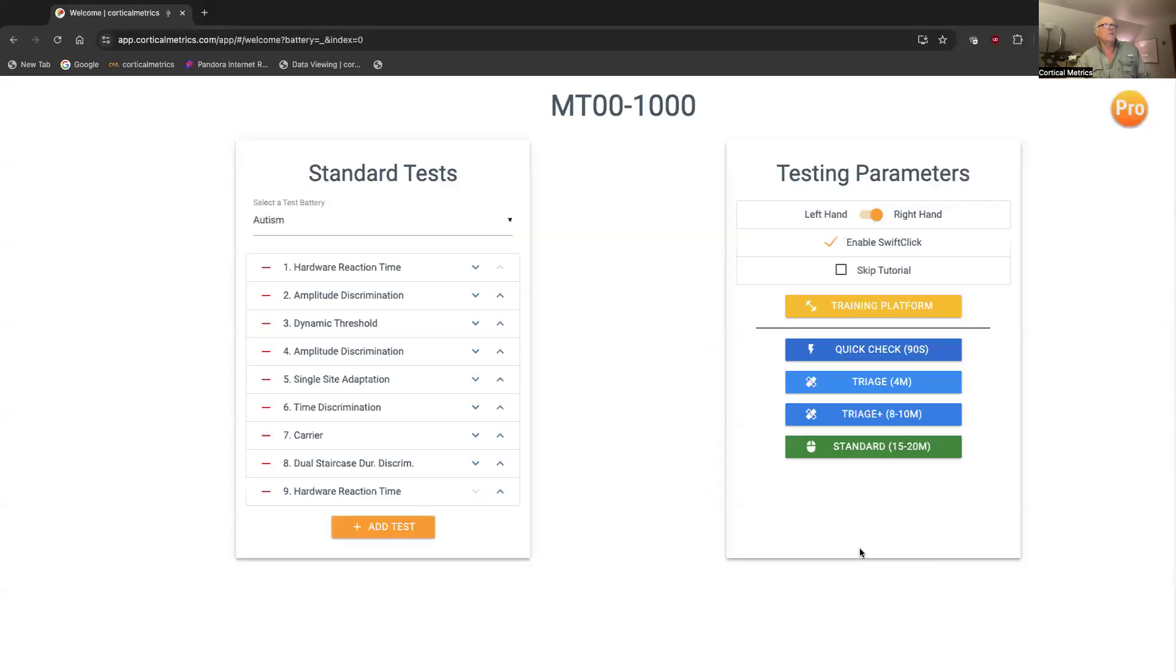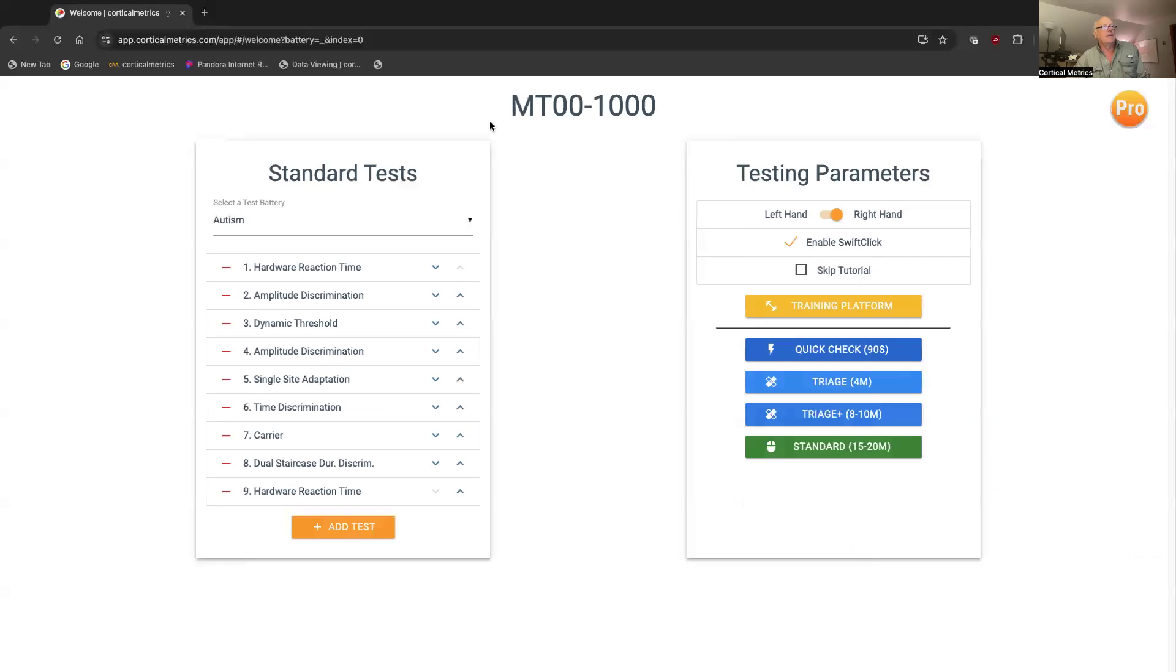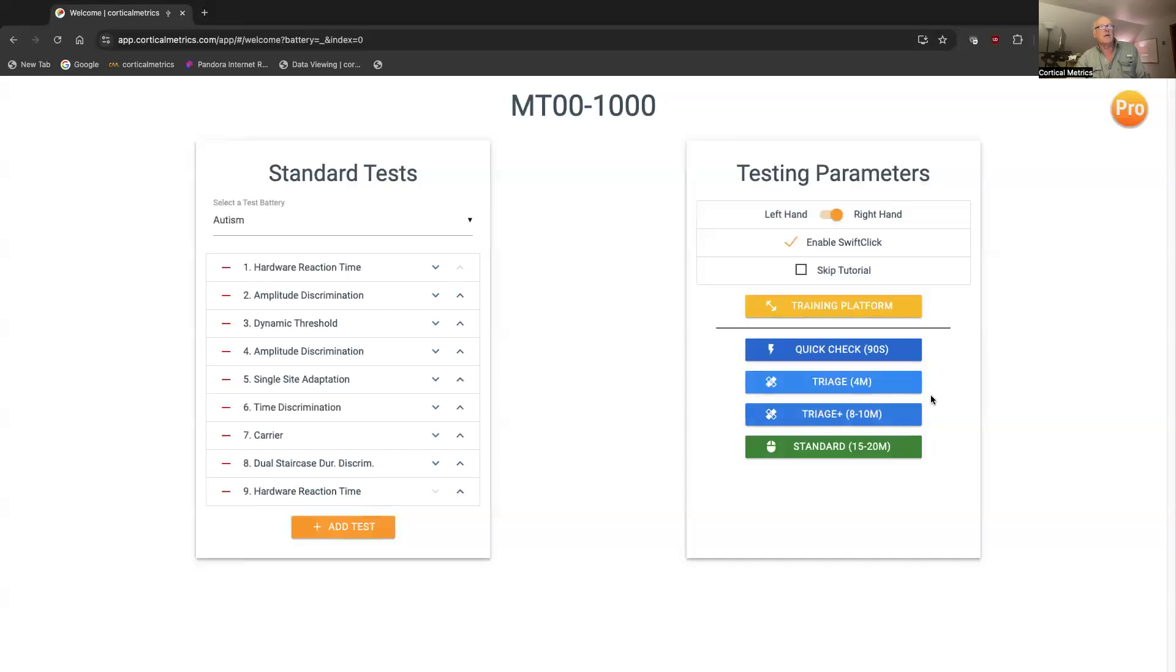And then the options page comes up. This is my identifier. This is a test subject that we're doing. And then you've got all these options like training platform, quick check, the different tests of triage, triage plus, and standard.